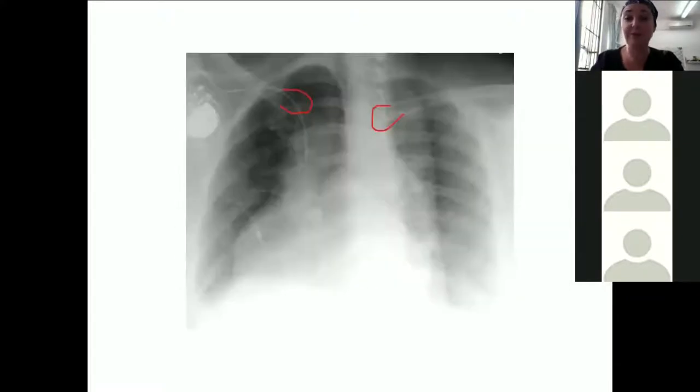But if you have a look at that first x-ray again and you see where those clavicles are, this definitely looks like the patient's rotated, which means that your cardiac silhouette is going to be on what looks like almost the wrong side of the x-ray. And it's very difficult to comment because your patient's just turned a little bit.